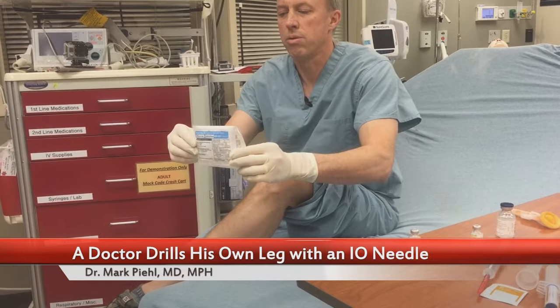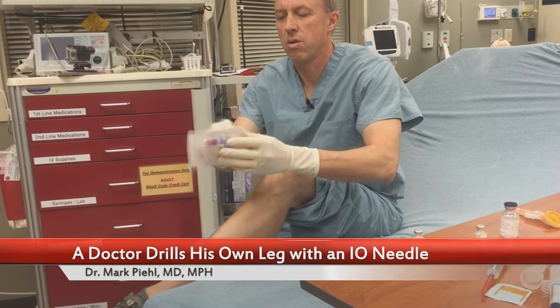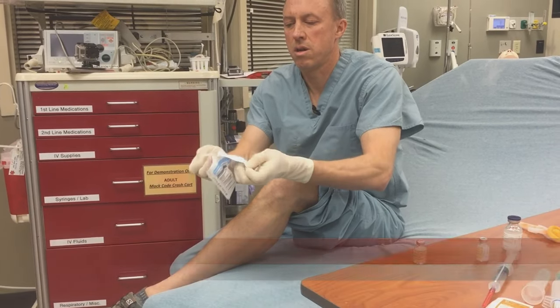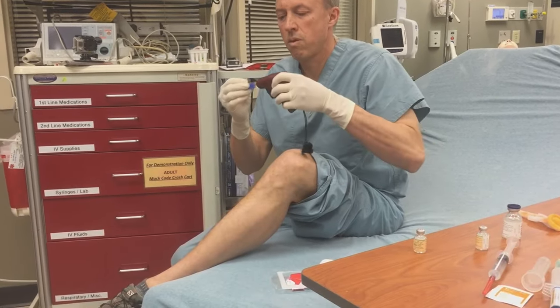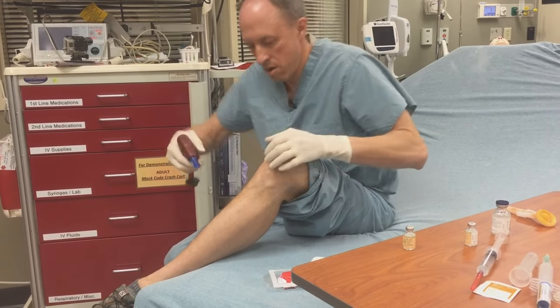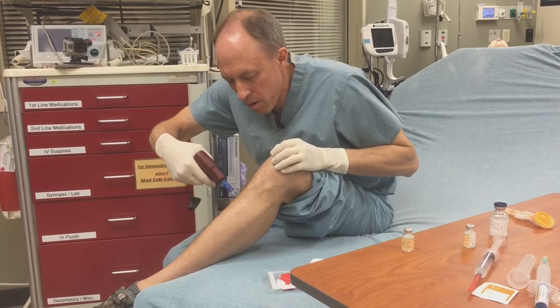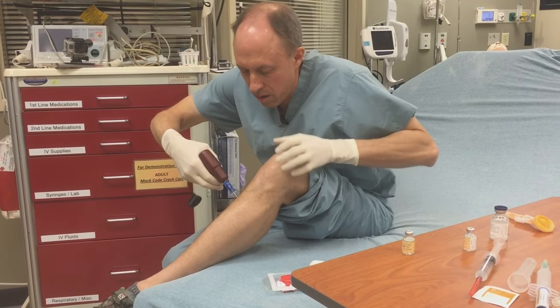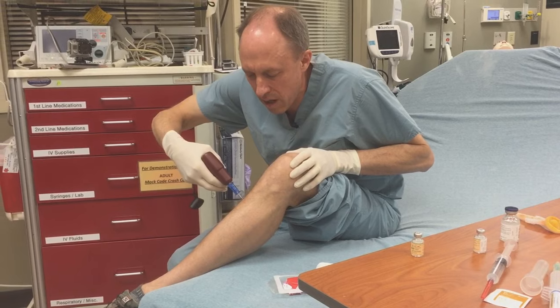The blue EZIO, which is the 25 millimeter 15 gauge drill. Put it right here — I can't feel it yet. I'm about 30 degrees angled in.